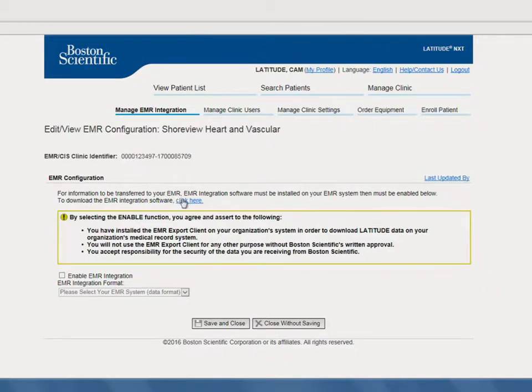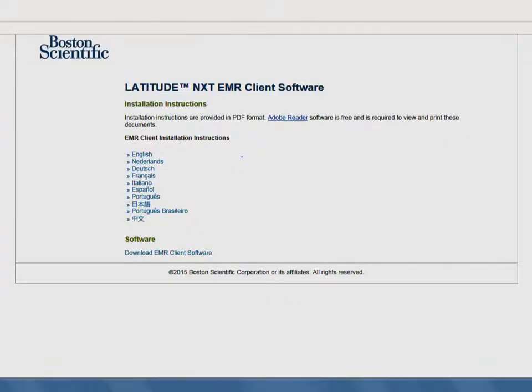Select the Click Here link on this page. A new window will appear where you'll proceed to download the EMR integration software. Either click on or download the instructions provided. Follow the EMR client installation instructions, which will walk you through the installation, configuration, and registration of the EMR client.